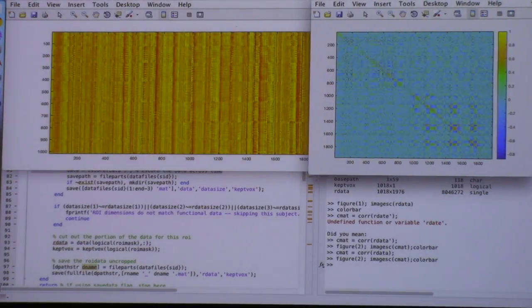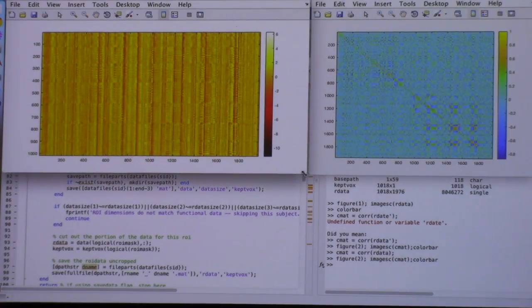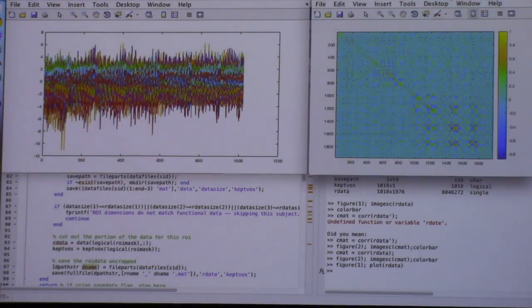So whereas the global mean regression in functional connectivity produces anti-correlations, this will produce negative correlations between the patterns. If you have a certain pattern that's correlated between two time points, you have to have another pattern that's anti-correlated. So when you do the time-time correlation patterns, you will see negative correlation. It doesn't necessarily mean the brain is truly expressing a negative pattern. It could be, but this pre-processing step, which we kind of need to do, is introducing the same issue.